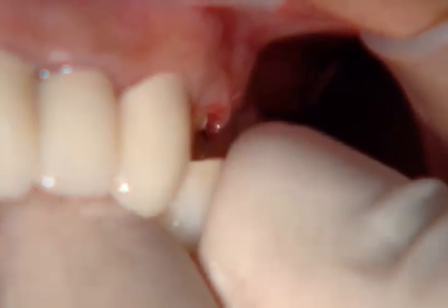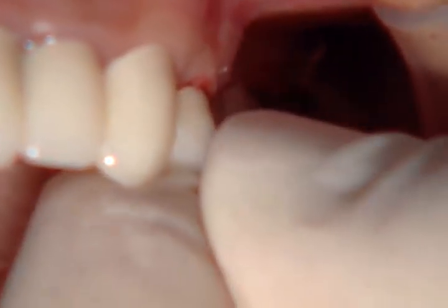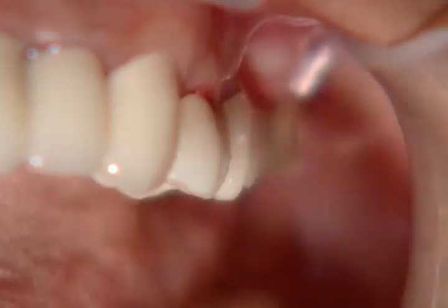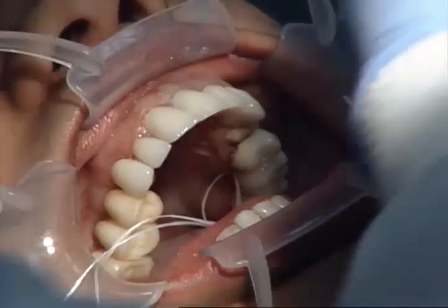But I can just tell you from the tests we've done in and out of the mouth with these zirconia restorations, I simply haven't seen a framework break yet. And in that respect, it's a lot like metal. I haven't seen a framework break. Have I ever seen porcelain chip off of it? Yes, I have. But that's a different story than seeing the framework actually break.